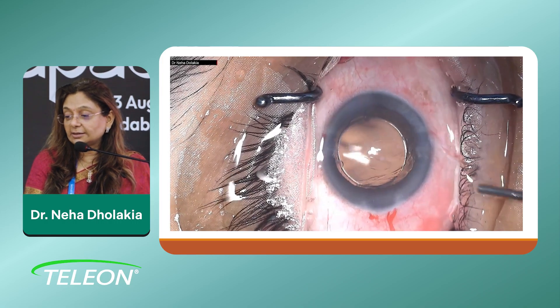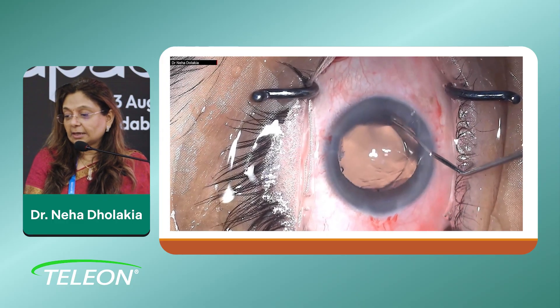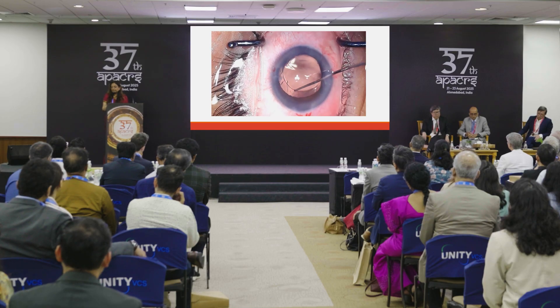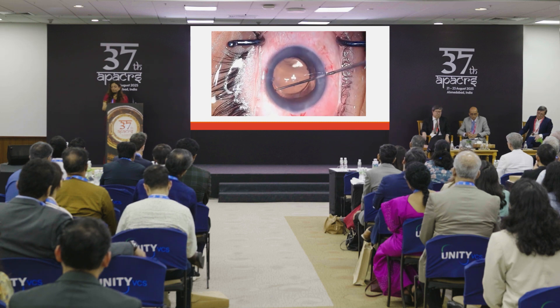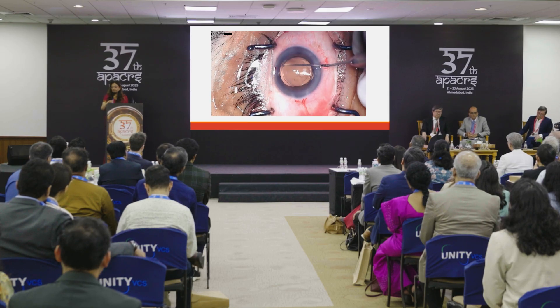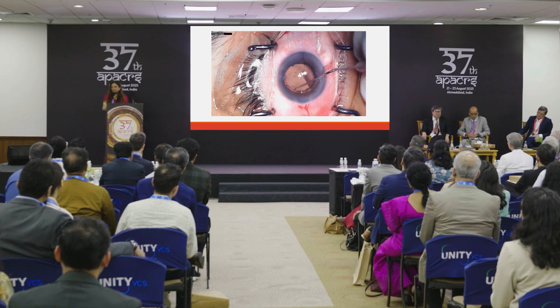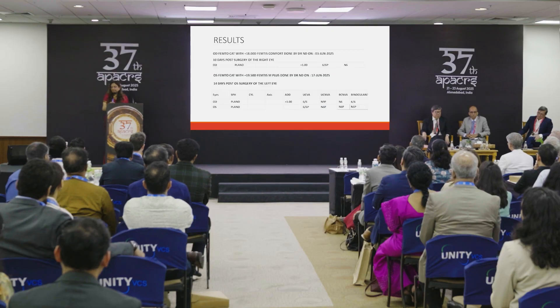After the lens is injected in the bag, it takes another 30 odd seconds. This is the leading haptic which you have to enclavate — just lift it up and put it over the capsule. And the trailing haptic. Now we have the two small flanges. If I have entered from the right side port, I like to do the enclavation 90 degrees away from there — that makes it very simple. This is enclavating both the smaller flanges, and this hardly takes 30 seconds extra over and above your surgical time.